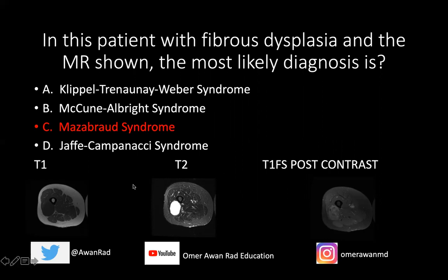A clue that this is an intramuscular myxoma is that it's light bulb bright on T2, and there's a little rim of fat around part of the lesion. A myxoma can have a rim of fat or bright signal along either the superior or inferior margin. Inferiorly we don't see it, but superiorly we do see a small rim of fat.